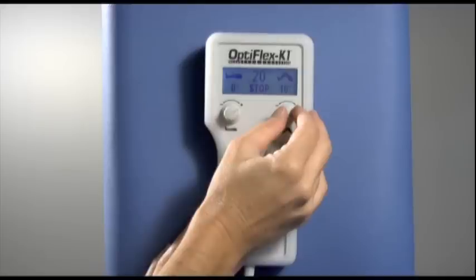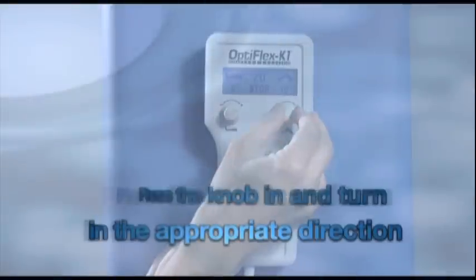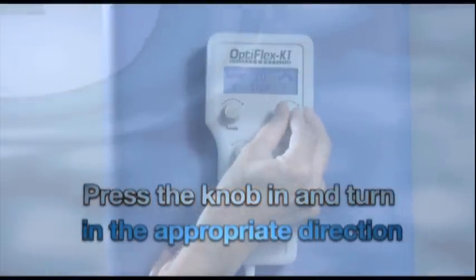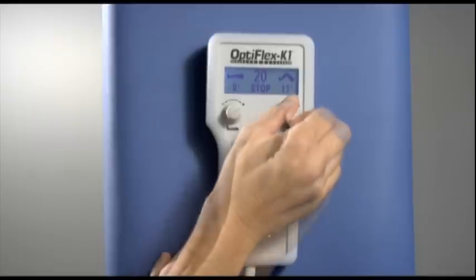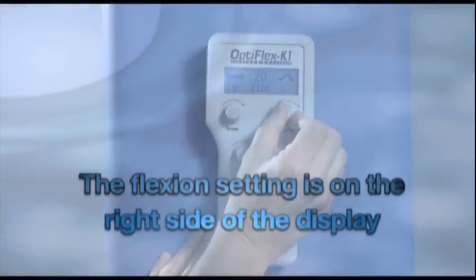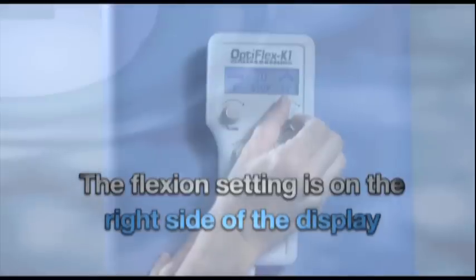To adjust the flexion limit to your prescribed or desired limits, use the flexion knob symbolized by the picture of a bent leg. Push the flexion knob in and turn in the appropriate direction. Note on the hand control that the flexion setting is on the right side of the display.